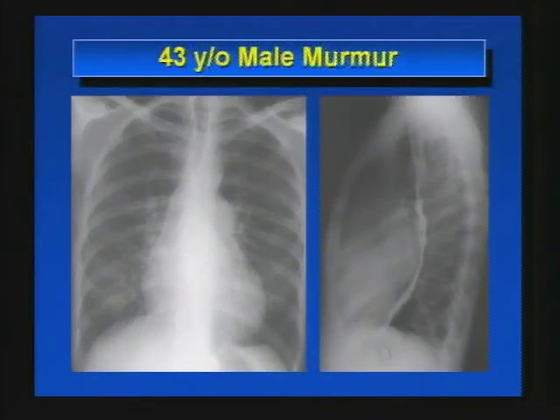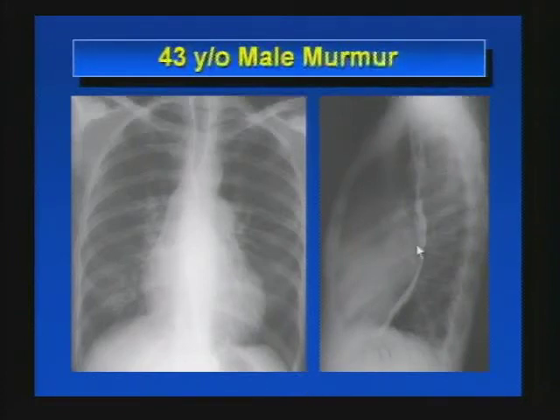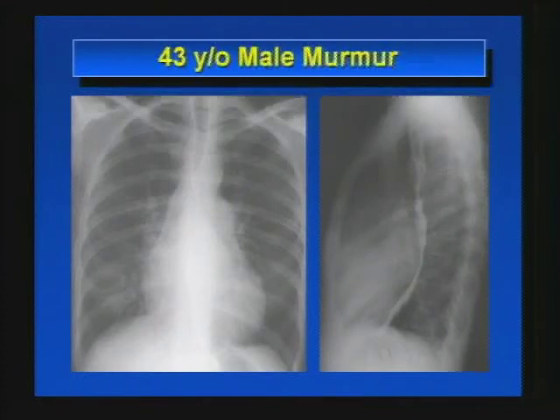Next case: 43-year-old male with murmur. If you remember from Monday, we reviewed a systematic approach to plain film and acquired heart disease, starting with whether the patient has a small or big heart. This patient has a normal heart size. We look for signposts — left atrial enlargement and ascending aortic enlargement. We can see left atrial enlargement with a double contour and compression of the esophageal contour on the lateral film. This is a small heart disease with signposts pointing to the mitral valve, consistent with mitral stenosis.